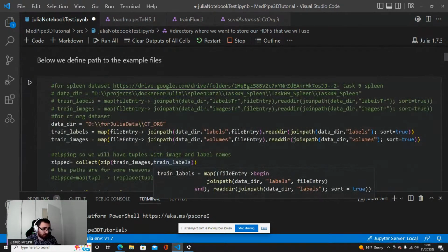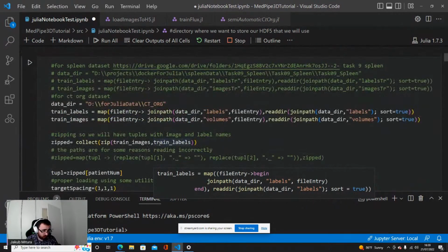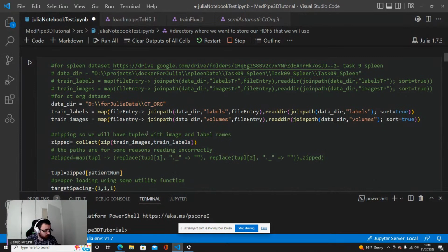With this particular implementation, I will show a more stable implementation at the very end, but this is relatively slow to train.